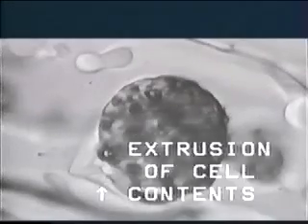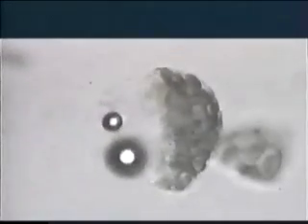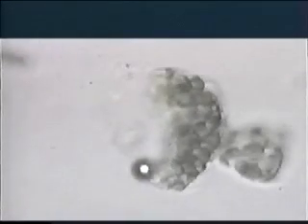First, the extracellular environment melts, and as the intracellular environment is melted, the cellular structure fractures and the membrane peels away.